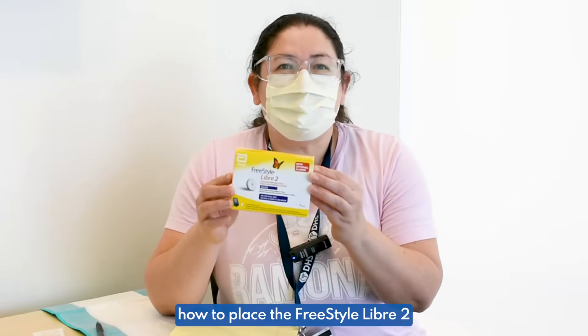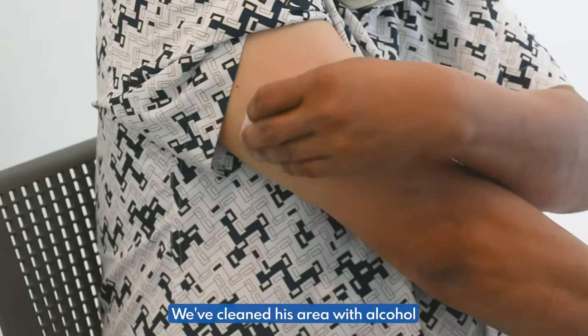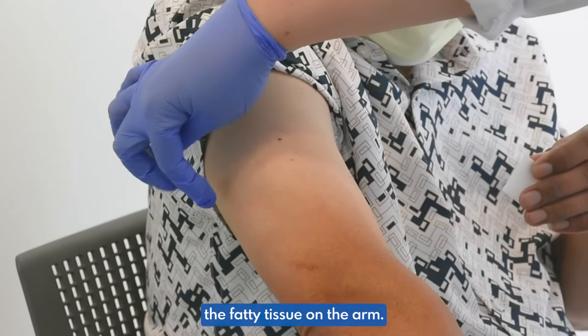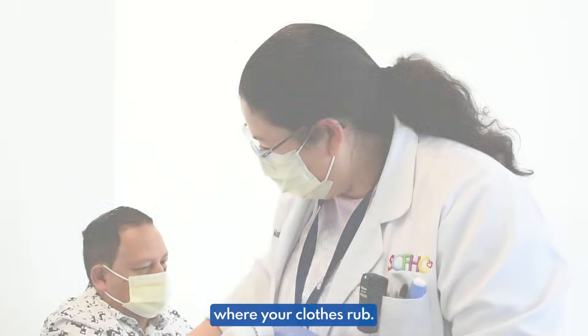We're teaching how to place the Freestyle Libre 2 and the Freestyle Libre 3. We clean this area with alcohol and we usually choose the fatty tissue on the arm. You usually want to do it kind of on the side, not too under where your clothes rub.